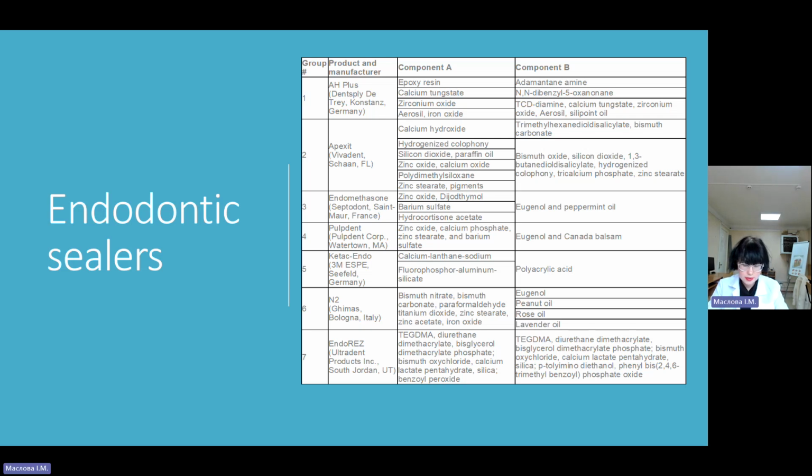According to the manufacturer, this is a non-irritating radiopaque sealer. What about the extended working time version? The extended working time version has a setting time in excess of 6 hours compared to 20-40 minutes for the basic formulation.